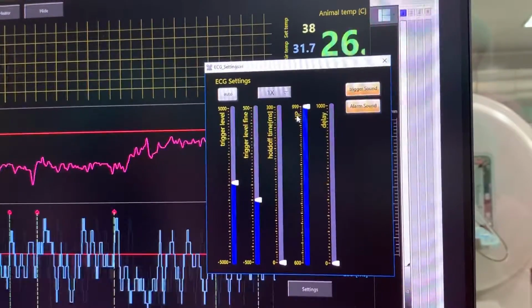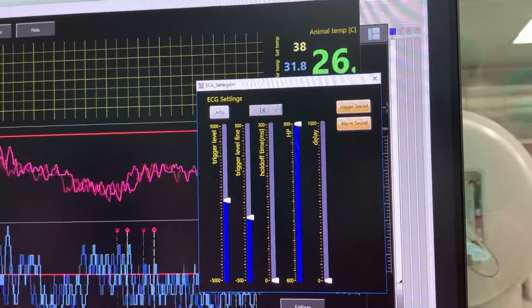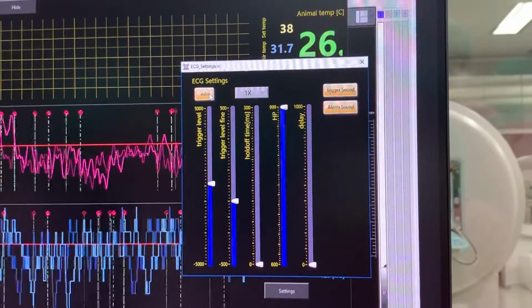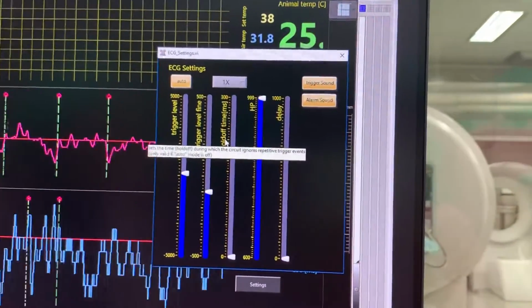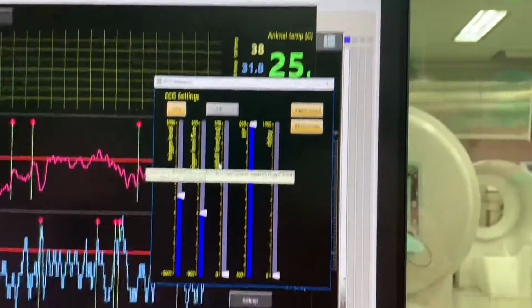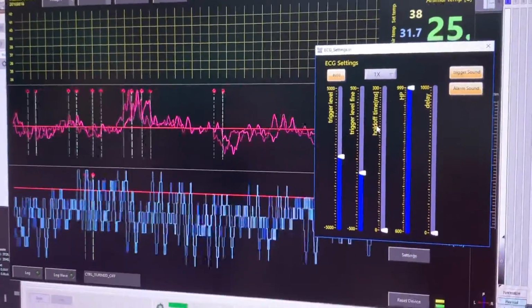Yeah, so that's something we never use, and the delay is only used by the MR scans, so it's not something you will need. Yeah, that's true. So right now the hold off time. Now it's like what you're saying, if the respiration, the breath, will affect the ECG signal, then we shall turn it on.